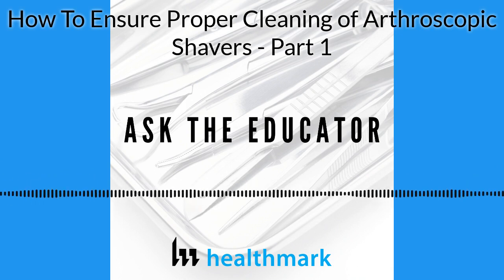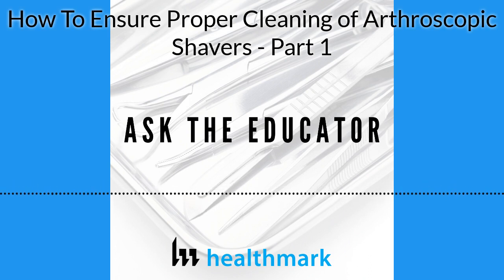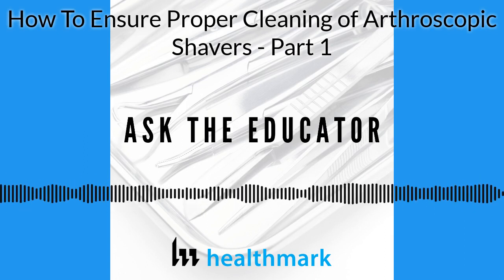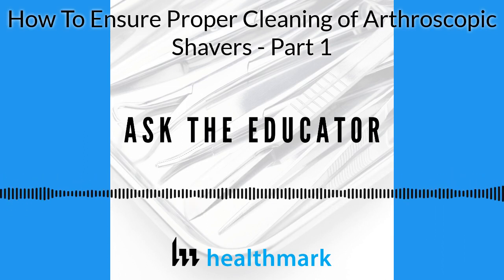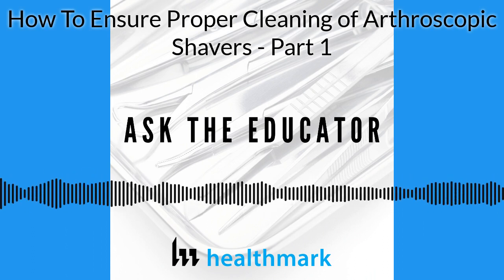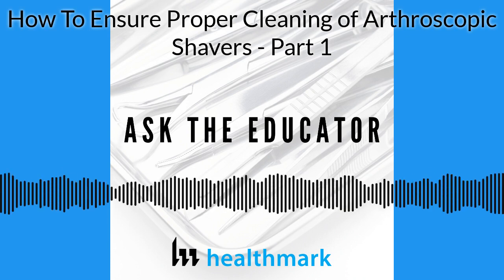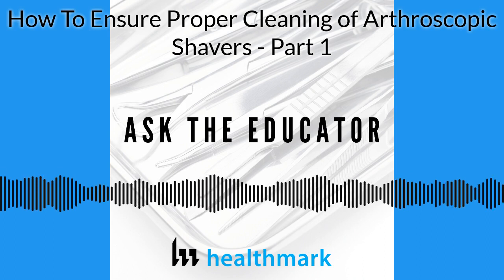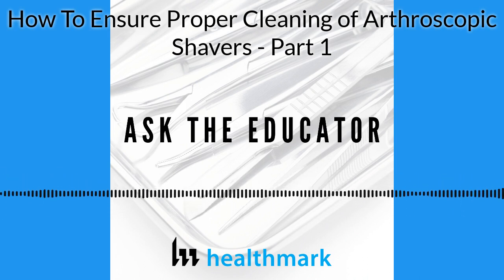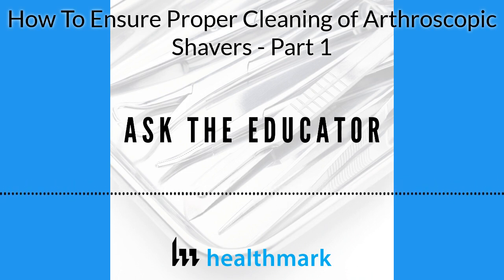So, that just reminds me of something, that being able to take pictures and save them, whether you get a brand new shaver or you sent one out for repair, you can inspect it incoming to make sure when it's brand new, what defects or it's okay. I do have a real life true story here. I can't say who the person or the account was, but they actually sent some shavers out for repair. They got a borescope. They came back and they checked it, and there was rust in the fork barrel area, and they sent it back, and they told the place they didn't fix everything and didn't inspect it, and it came back. And the reason they had it is they had a picture of what a brand new one should look like.